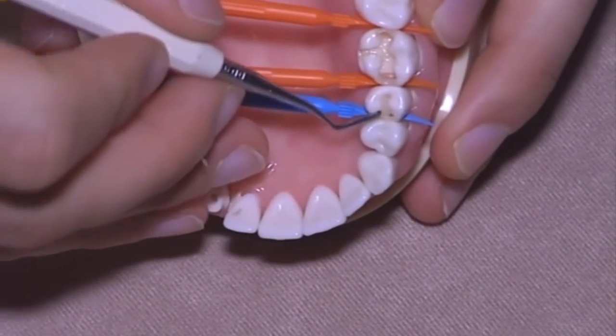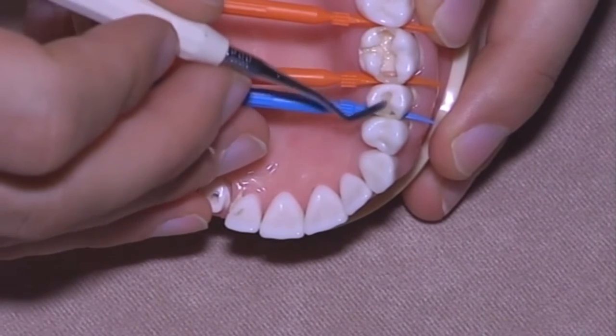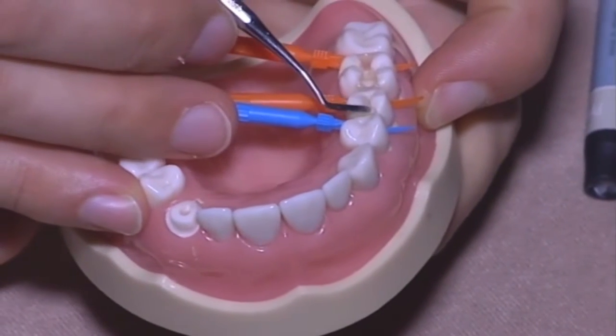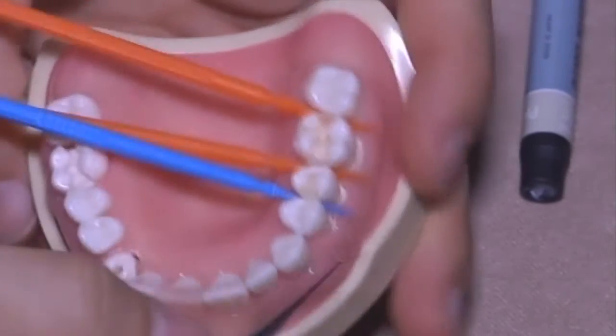With the spatula, usually we already have the tooth telling us the anatomy. So just follow the anatomy like this, placing the first layer of composite.